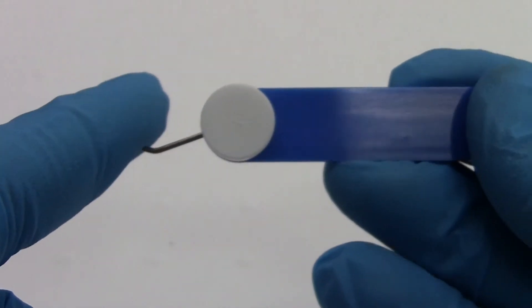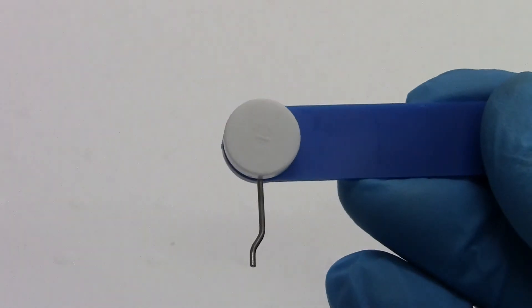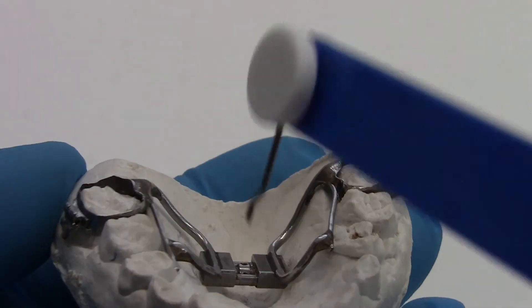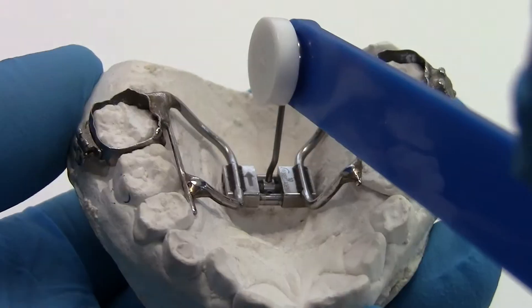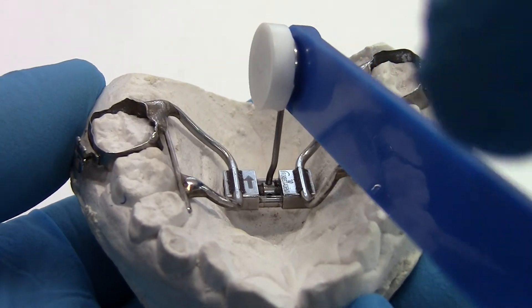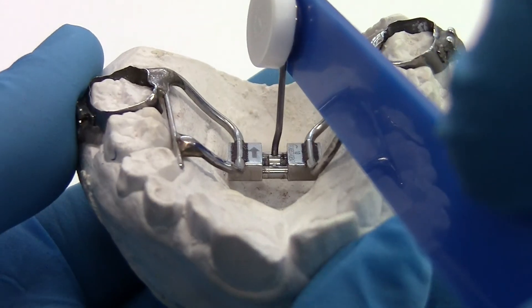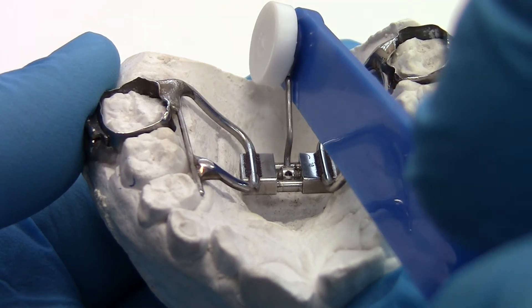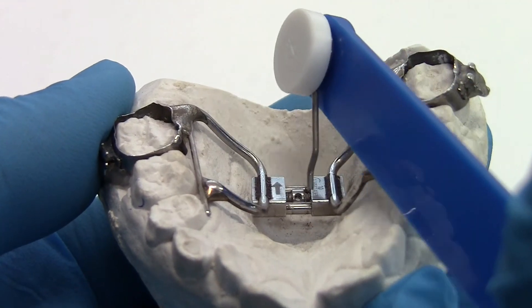If that's the case, put your key at a 90-degree angle, then finish off your turn. Once you have done that, you should be able to see the next hole.